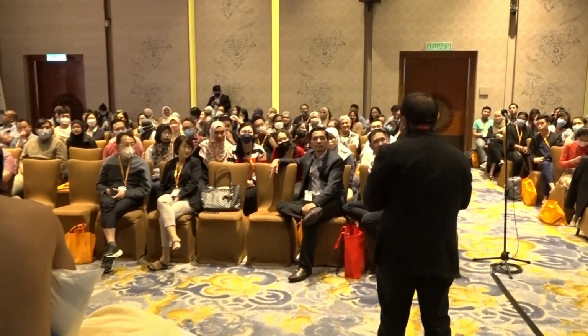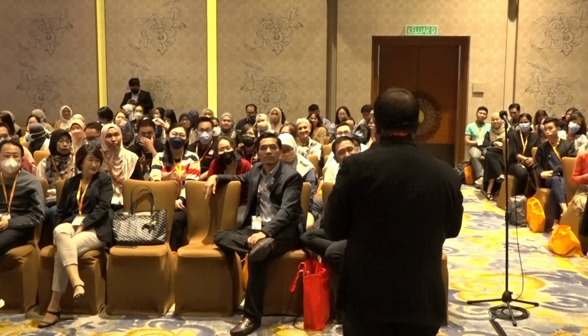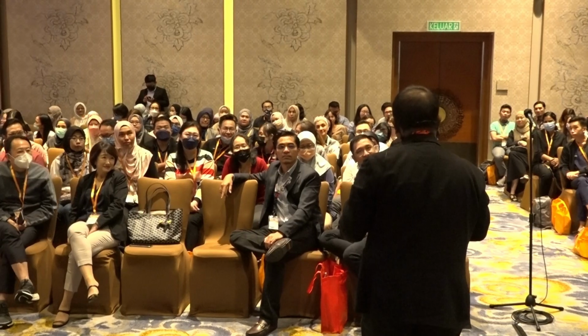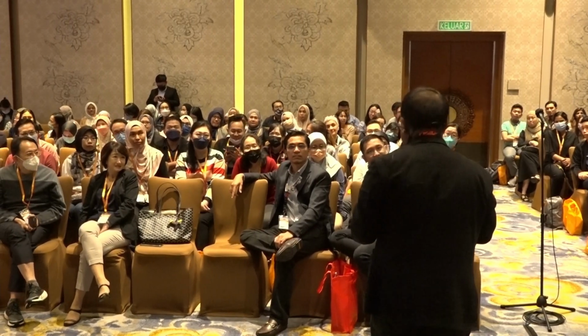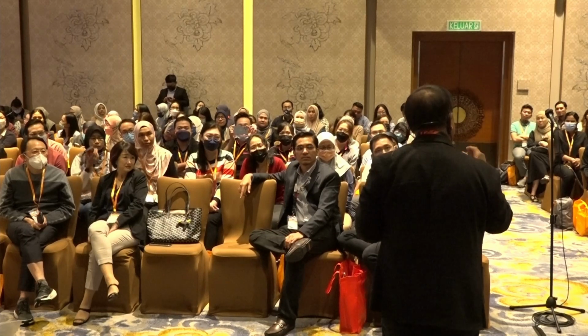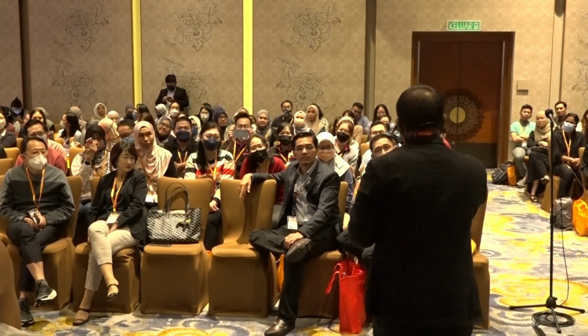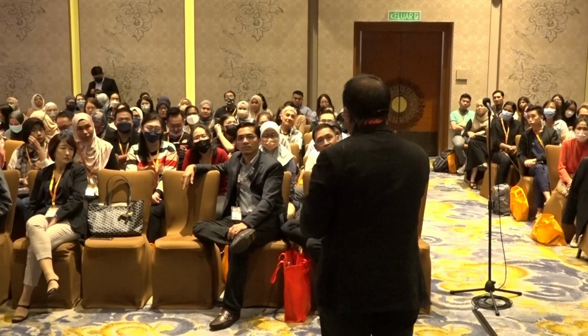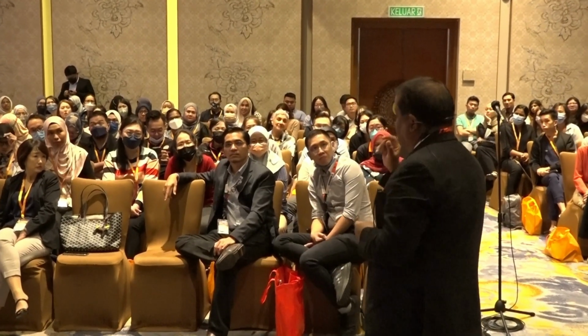It's very scary. You go very close to the pleura. That's very true. That's why whenever I train paravertebral injections, I'm always saying, where is the tip of the needle? Because what you see may not be the tip of the needle. So one of the things you must be able to do as an up-and-coming regional anesthesiologist is to track that tip, because that tip does the damage. If you cannot track the tip, then your patient is at risk.